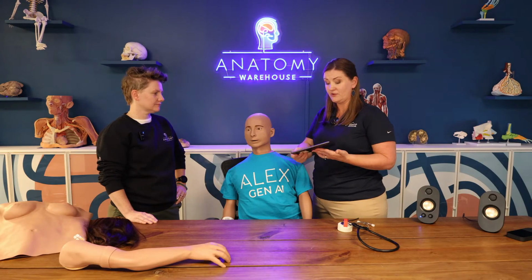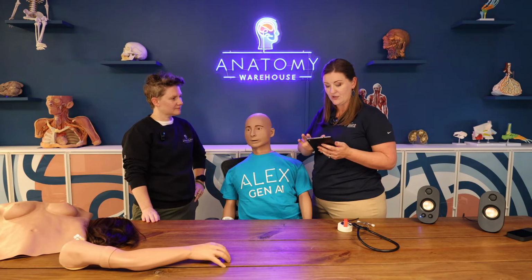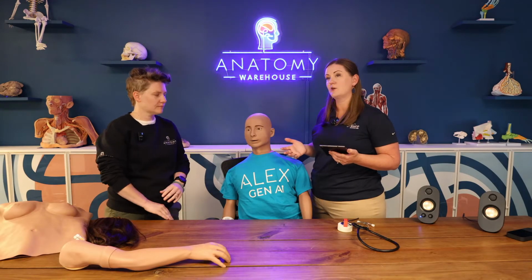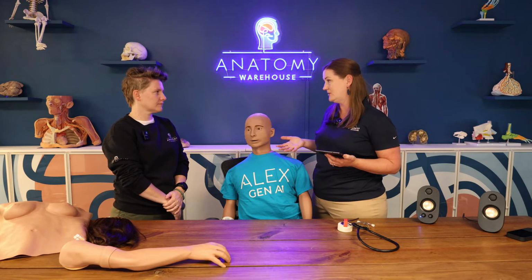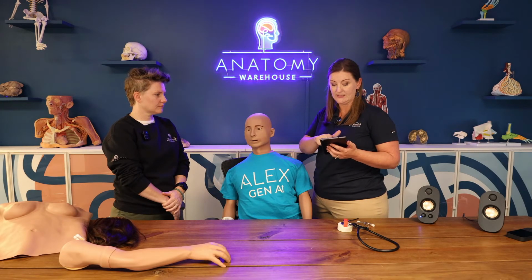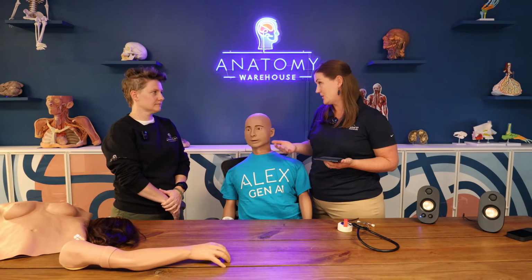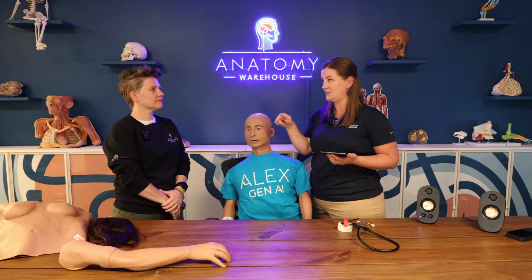The other thing that they can do too is that there is a very large space where they can add and do any kind of different checklists. So some instructors like to allow students to just come, interact with the mannequin, do what they need to do, capture the feedback, and then move on with their day. And some instructors like to really take a look and see what the students are doing and follow along. So checklists can be created. They can sit and check and say, oh, yep, student X did this, they did that.